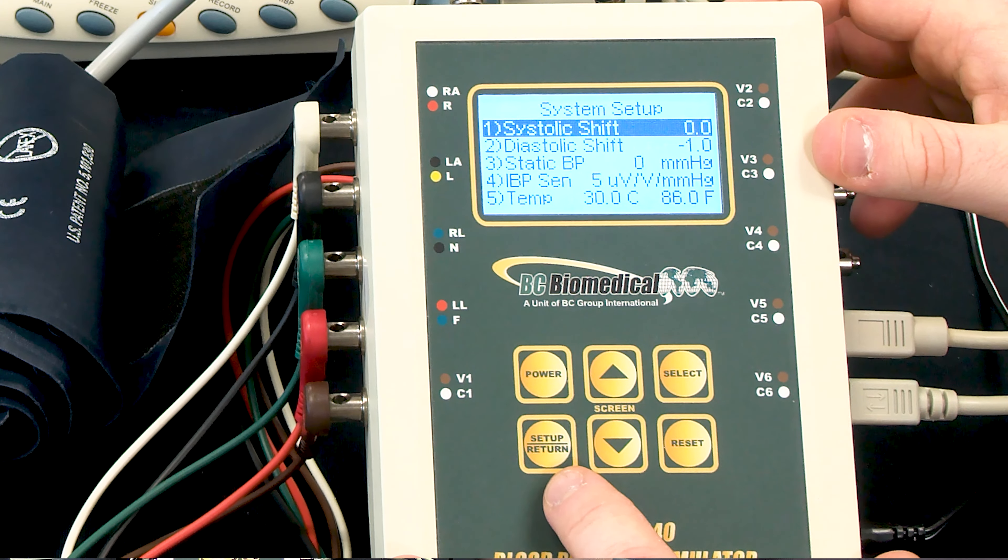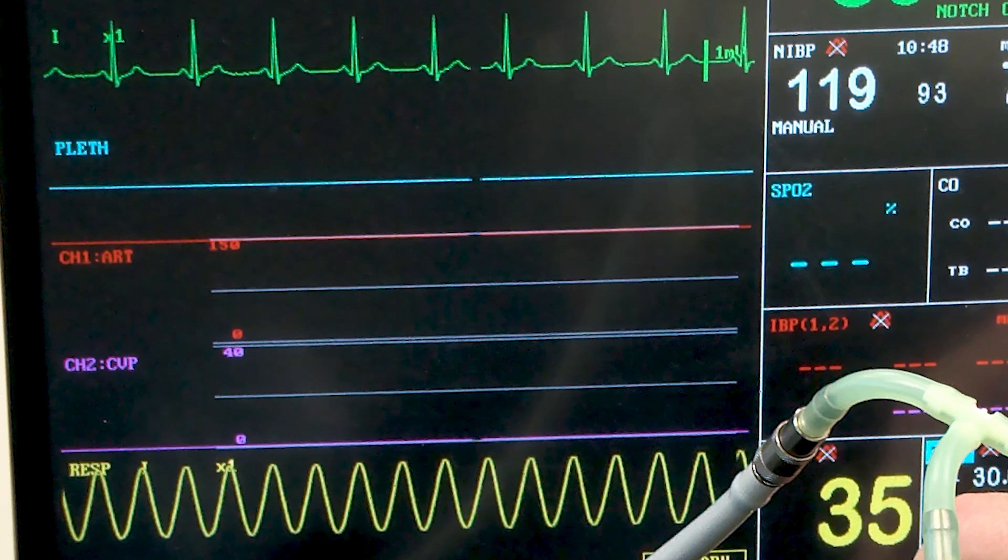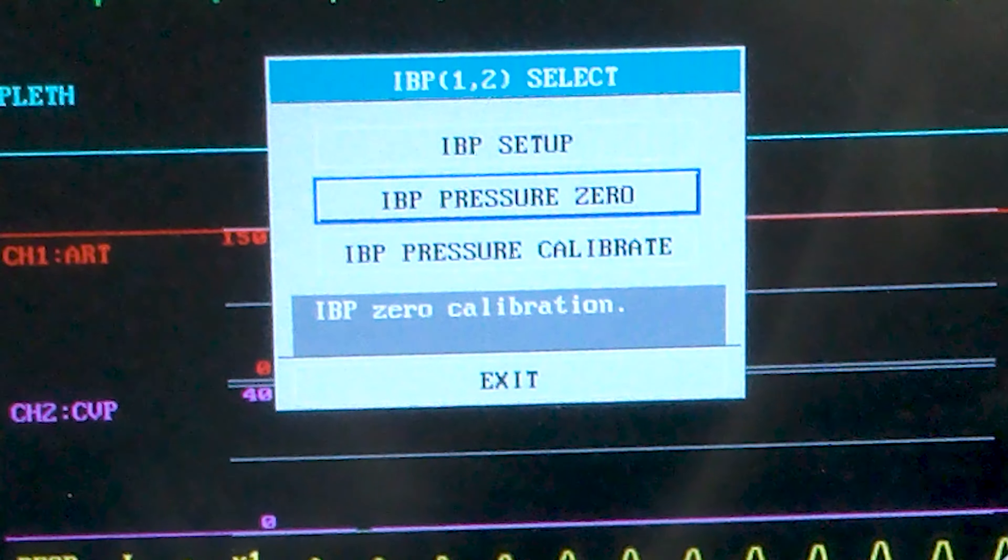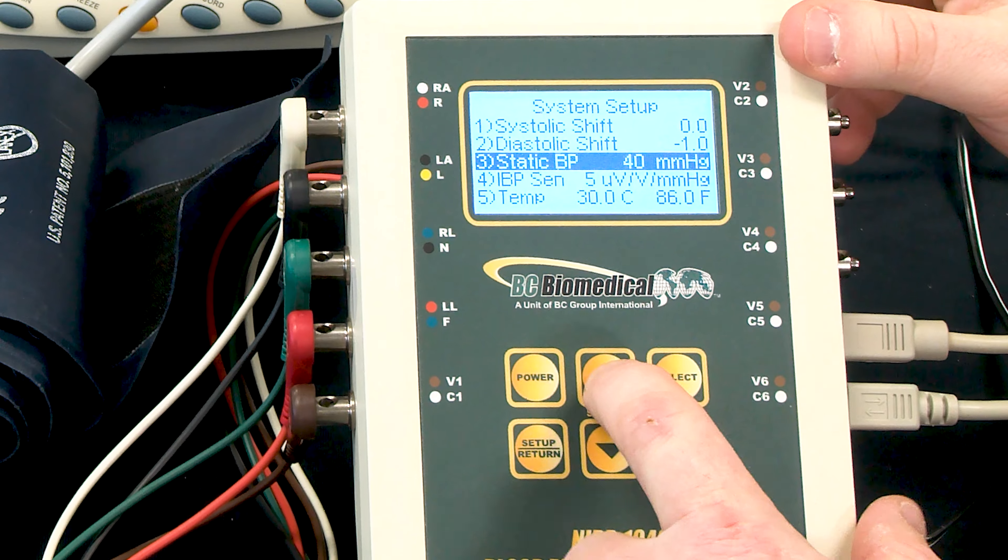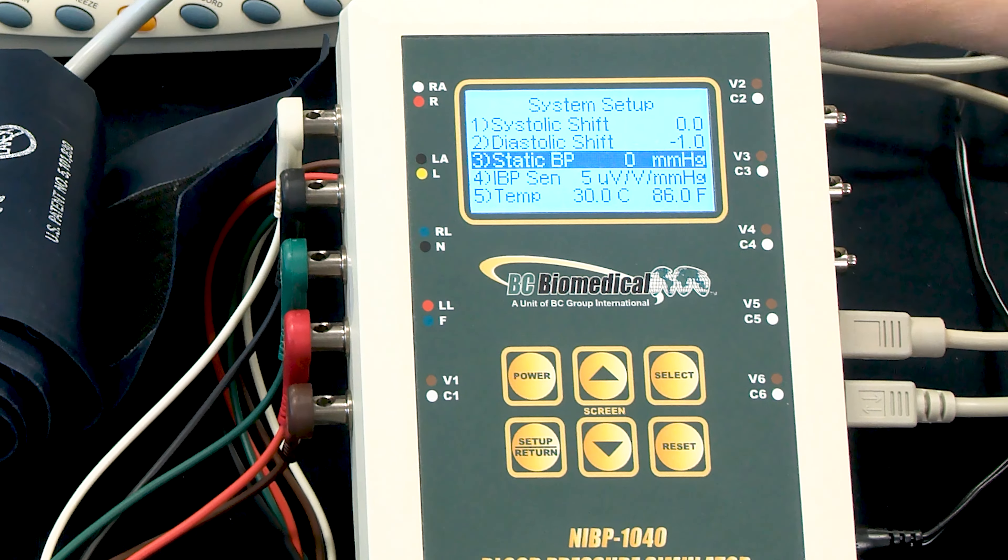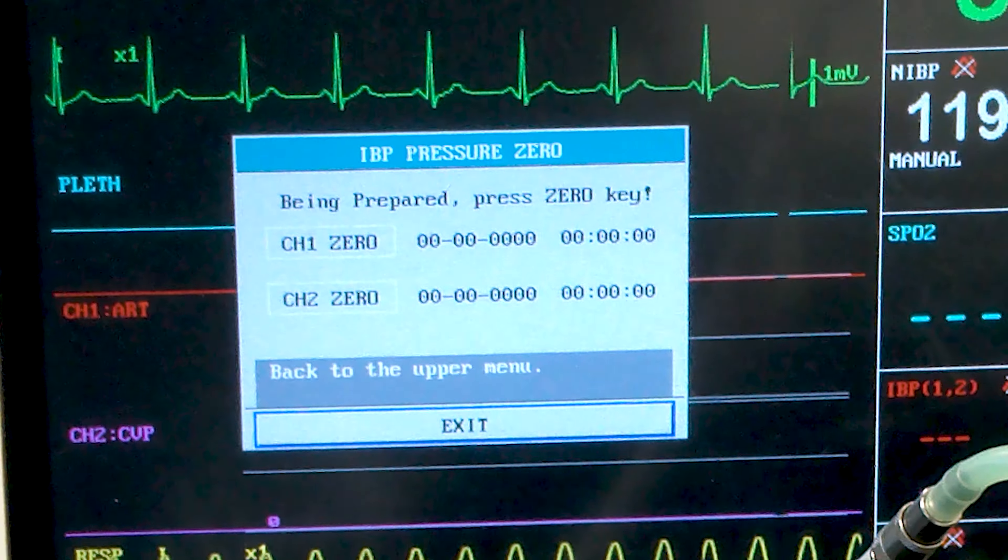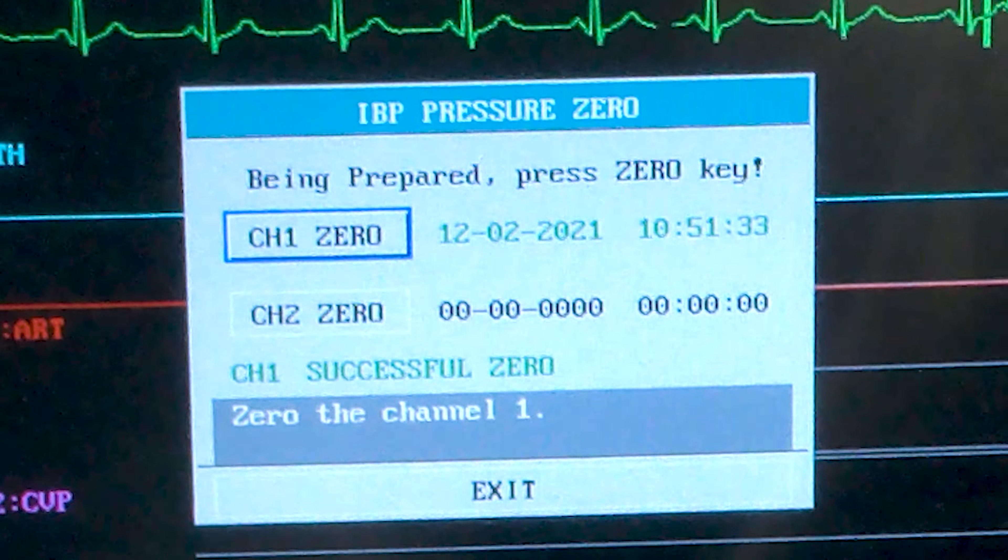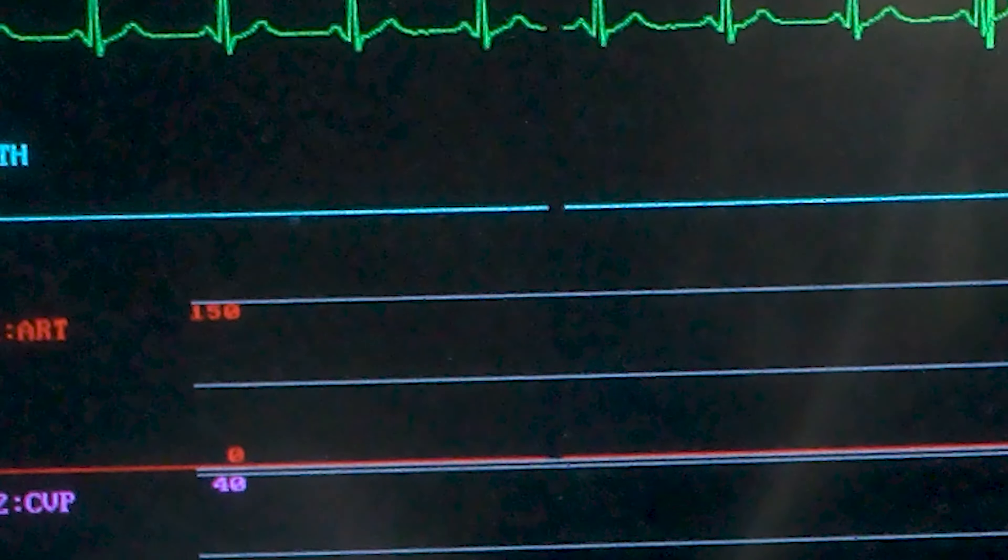So to do that, we'll go to a static blood pressure setting by going to the setup menu, and we'll go to the monitor configuration for invasive blood pressure, and we'll select IBP zero. Now we have to make sure that the static blood pressure is set to zero, and we can do that by scrolling to the static blood pressure and adjusting using the up and down arrows. So with zero millimeters configured, I press input zero on the monitor, and I tell it the channel that I'm connected to, and now we have zero pressure shown on the monitor.